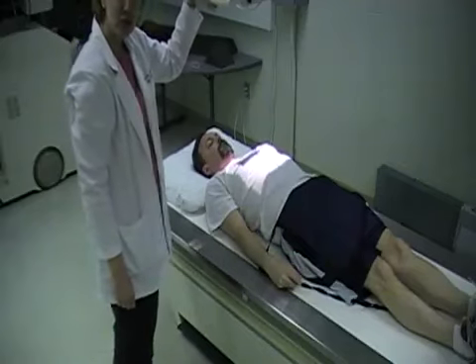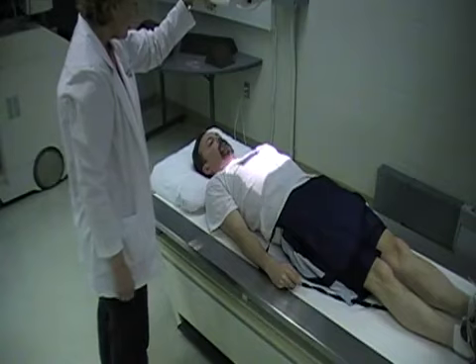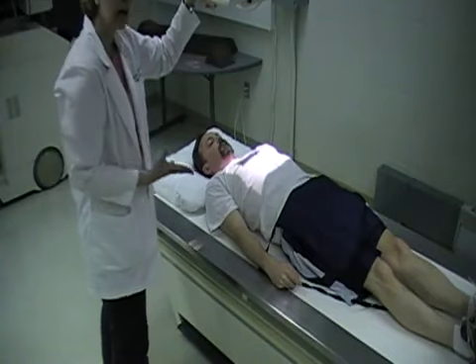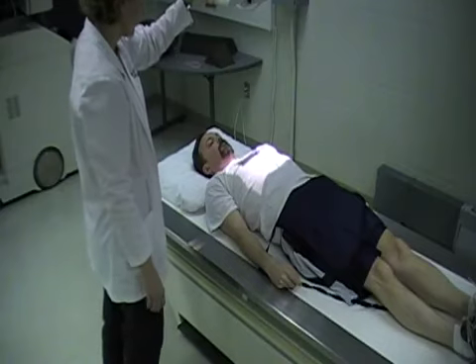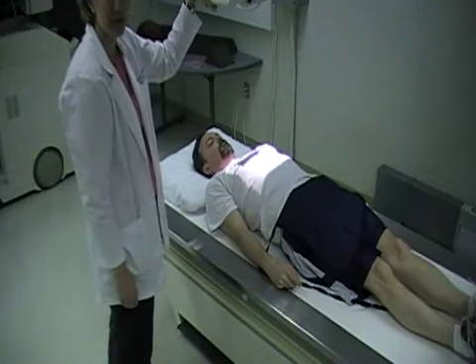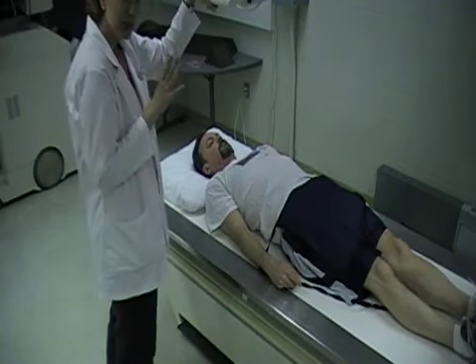We're going to do positioning for the upper GI for the stomach, and this is following the fluoroscopy images that the radiologist does for the upper GI. Now, let me backtrack just one moment.